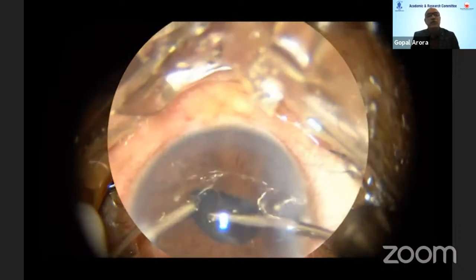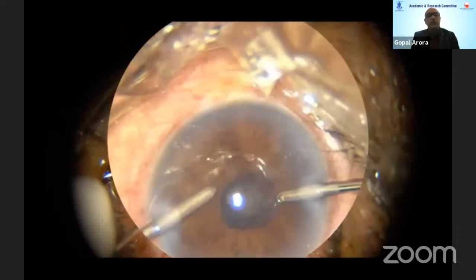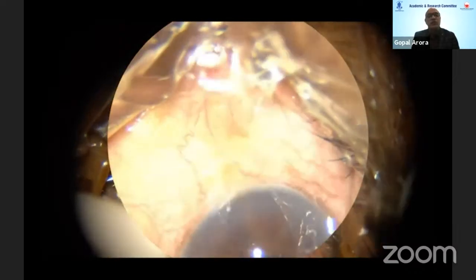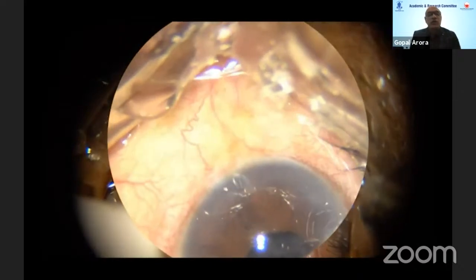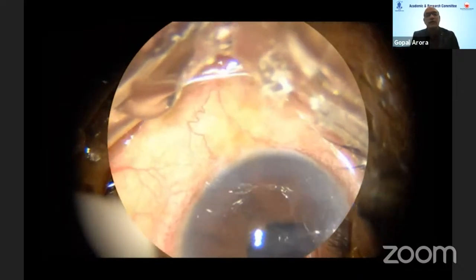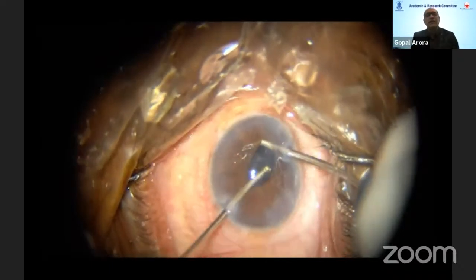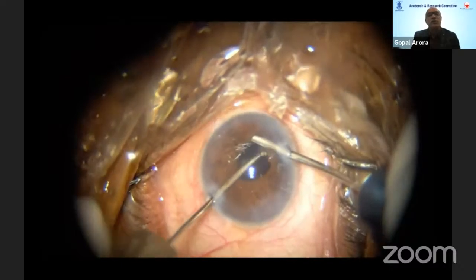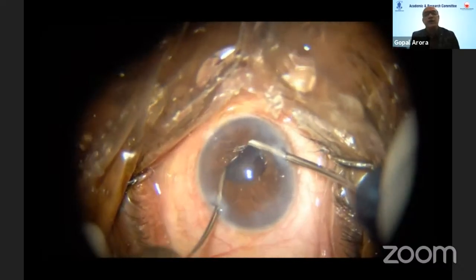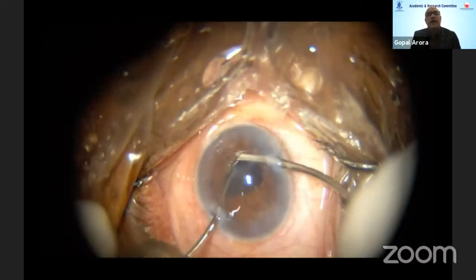You need to put in viscoelastic at times, which I have not done in this case, but it's for the beginners. You really need to put viscoelastic so that you don't catch the iris margins, because since you're not using the iris hooks or the pupillary dilator, you need to be really careful in this step. Rest of the step, I think it's not very important, because you can just polish. Only thing is that you need to form the anterior chamber intermittently by any viscoelastic substances.